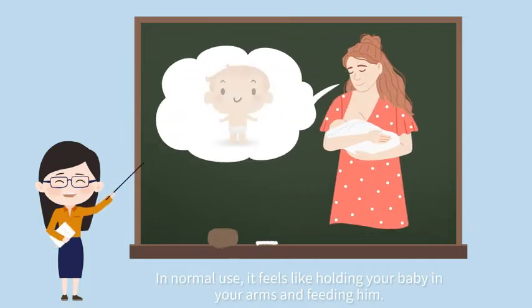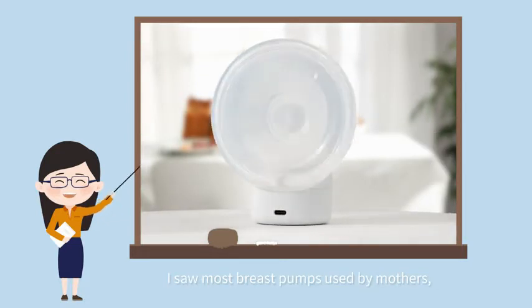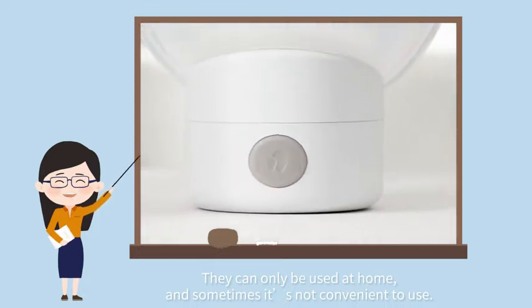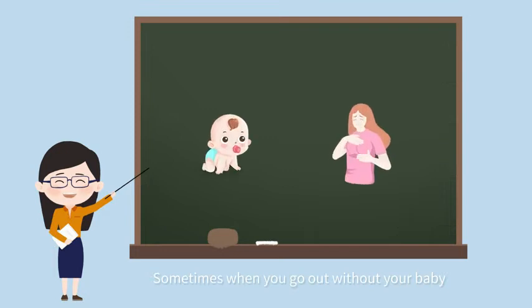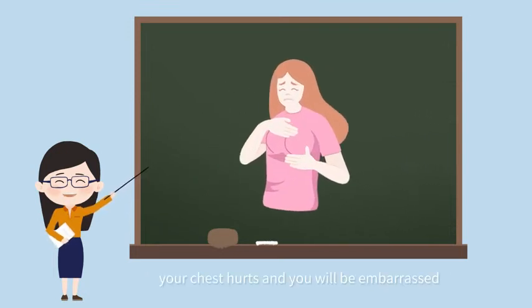In normal use, it feels like holding your baby and feeding him. Most breast pumps used by mothers can only be used at home, and sometimes it's not convenient to use. Sometimes when you go out without your baby, your chest hurts and you will be embarrassed.